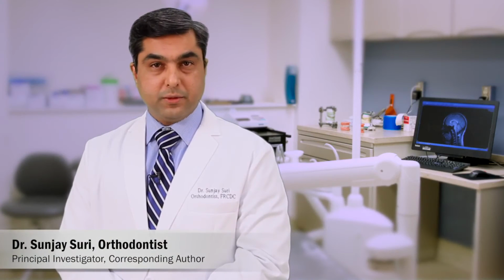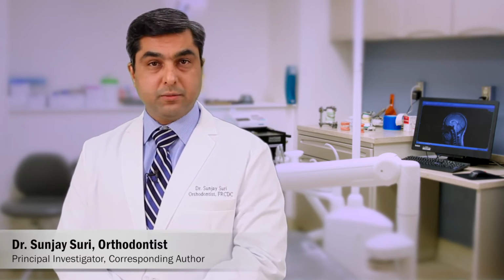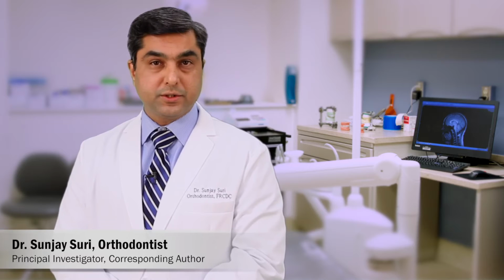To circumvent this problem, fixed orthodontic appliances and fixed retainers are often removed before a planned magnetic resonance scan or removed in emergency rooms of hospitals before an urgent MR examination. This delays timely diagnosis, interrupts orthodontic treatment, increases the financial burdens, and risks potential damage to the enamel.